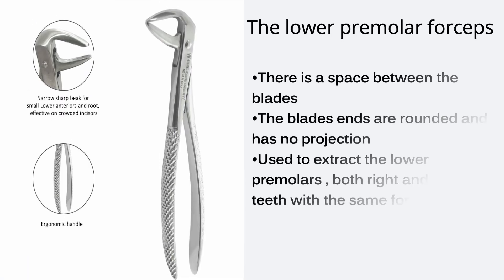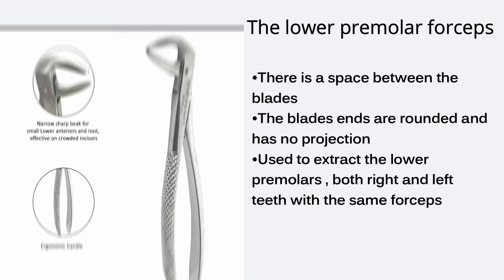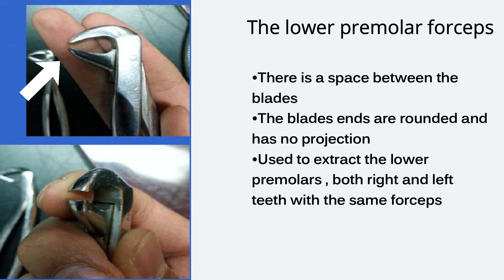Lower premolar forceps looks very similar to the lower anterior forceps but with space between the beaks. The blade ends are rounded and have no projection. It is used to extract the lower premolars — both right and left — with the same forceps.